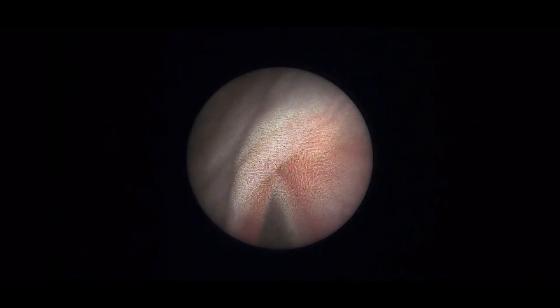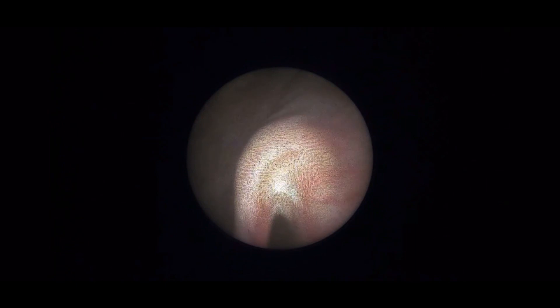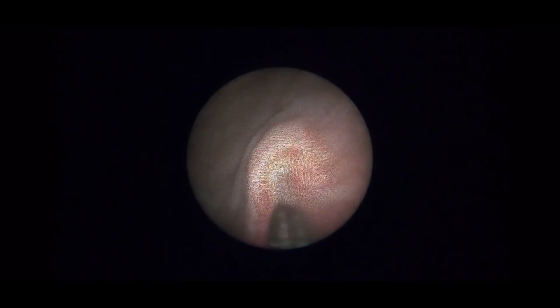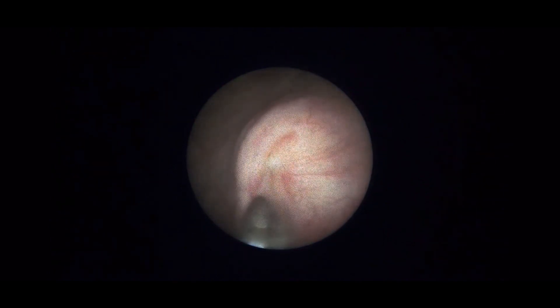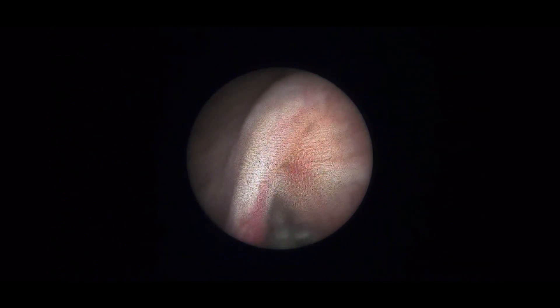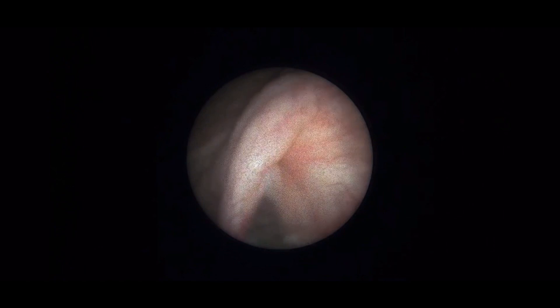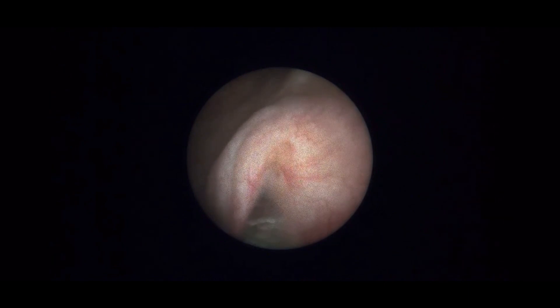We inject the Dexel, and as we can see, slowly the Dexel is being injected — it is not being pushed continuously. We often advise that the needle's position is slightly rotated, not much, so that the Dexel can be implanted at the base of the orifice. As we can see here, slowly a mound is being created. The purpose of creating a mound is to make this orifice slit-like so that future reflux can be prevented. Slowly Dexel is injected until a good mound and an appropriate slit is formed.